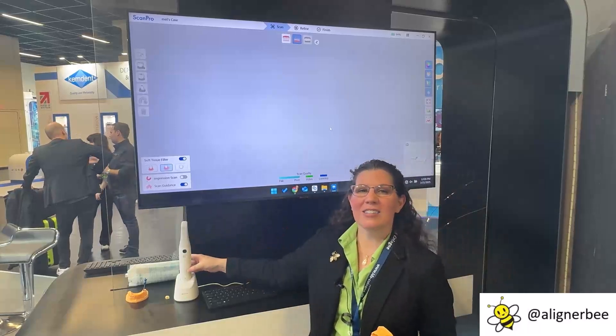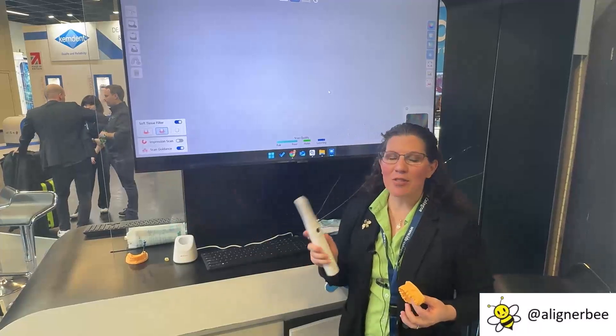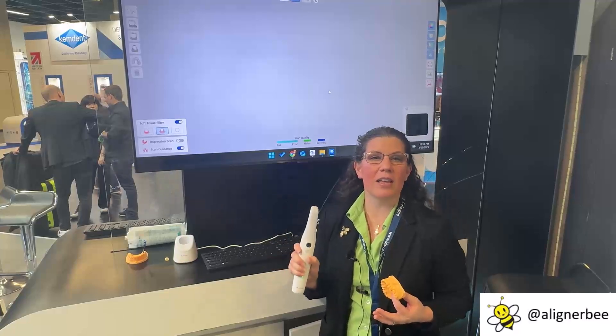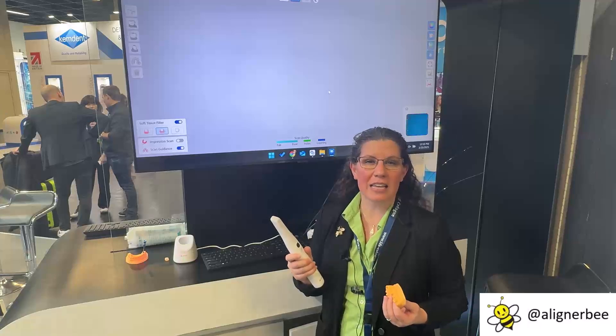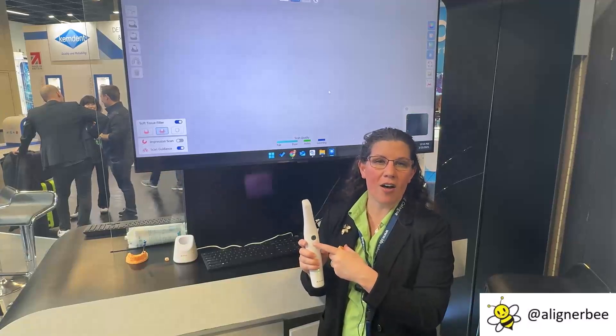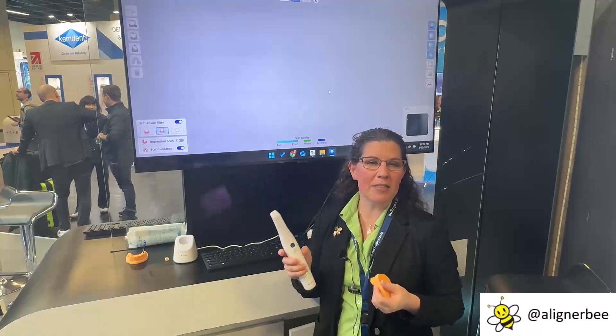When we see the new Allied Star scanner, it is wireless, so we have our charging station and the new scanning wand. The first thing I notice is that it is very lightweight and small in my hand. One of the features that I really like on intraoral scanners is when we have a manual button to turn them on and off or to switch between scans. With my small hands, I find these a little bit easier to use than a touchpad.